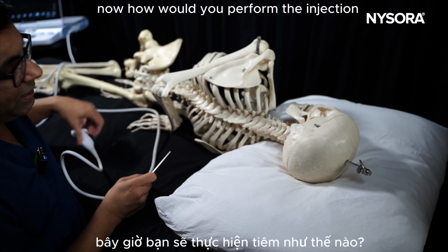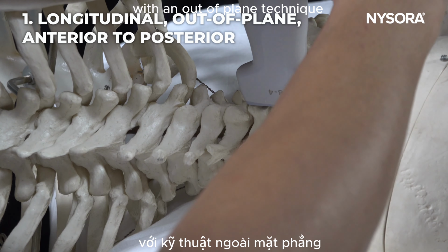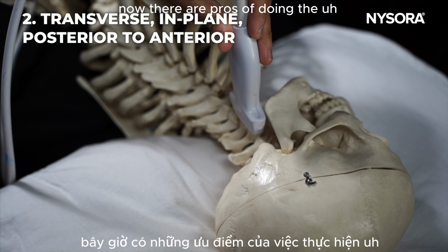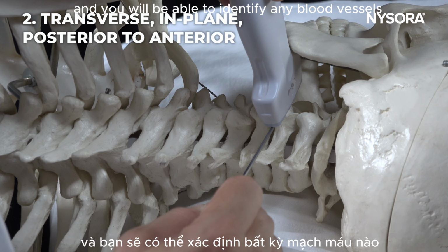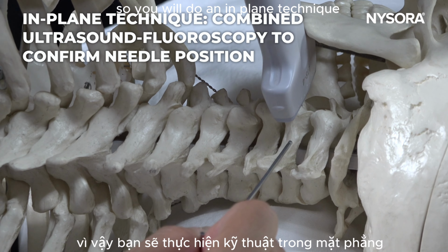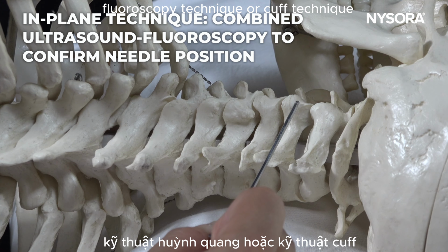Now, how would you perform the injection? You can do it in two ways. You can do it in the longitudinal view with an out-of-plane technique from anterior to posterior, or you can do a transverse view with an in-plane technique. There are pros to the transverse view because you can see the needle tip and you will be able to identify any blood vessels. This is the same technique you can use to perform radiofrequency treatment. You do an in-plane technique, put your needle in under ultrasound guidance, and then you do an X-ray. I call this the combined ultrasound fluoroscopy technique, or CUF technique.